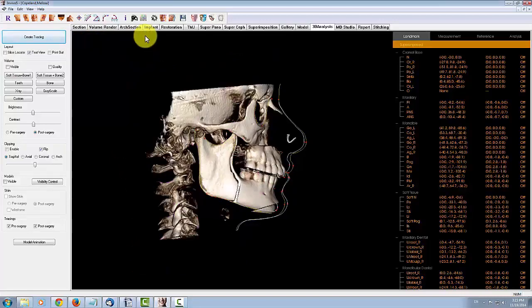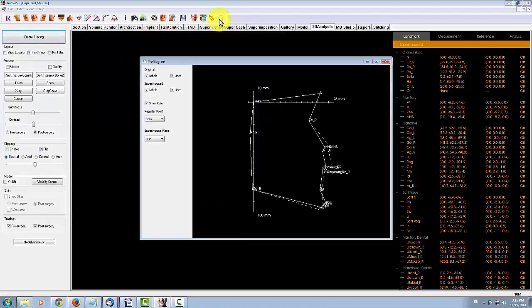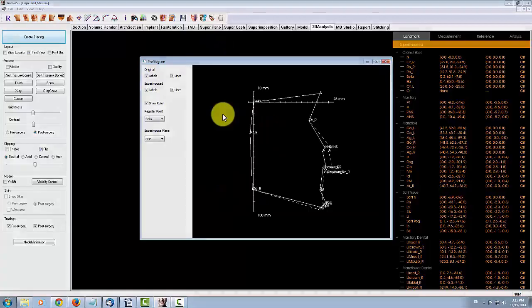There is an additional new tool called the Profilogram, which is a simplified 2D representation of the tracing. This is useful for a quick visualization of the tracing.